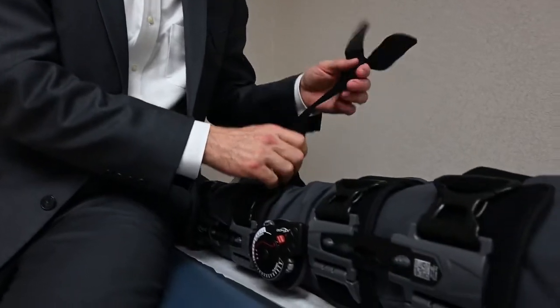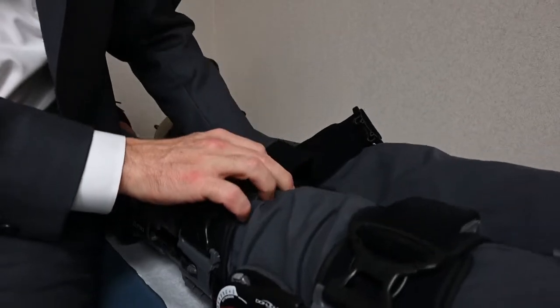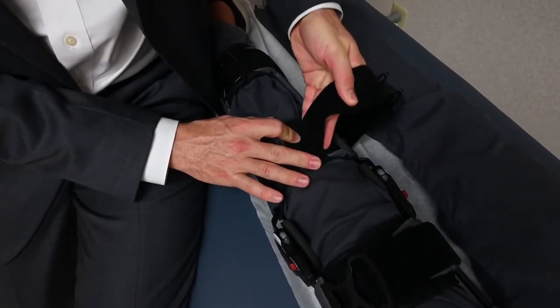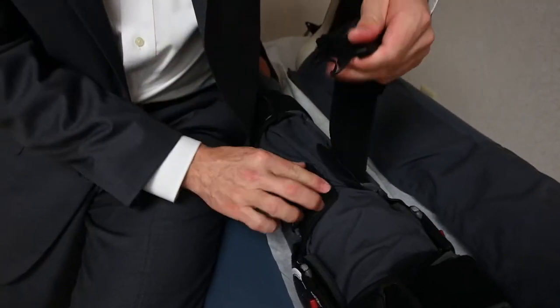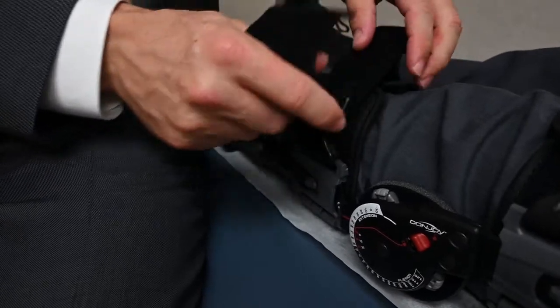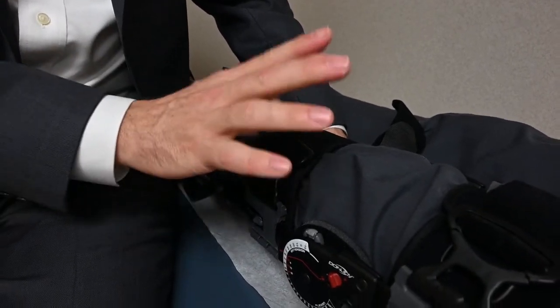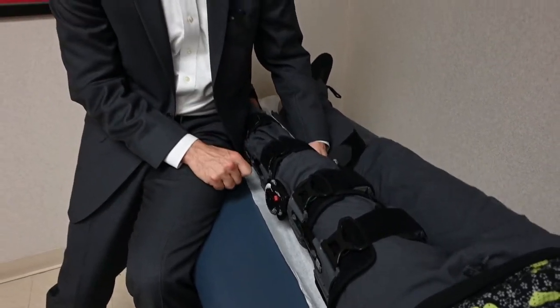The brace is meant to be adjusted in two phases. The first is the Velcro, which controls the strap that goes around the back of the leg. As you pull that strap up you can lay it down against the Velcro to tighten the back. You then want to adjust the front of the brace by applying the clip and then pulling tightly on the strap. Once it is set in both the back and in the front, you don't have to make further adjustments and can simply remove the brace off and on with the buckle.